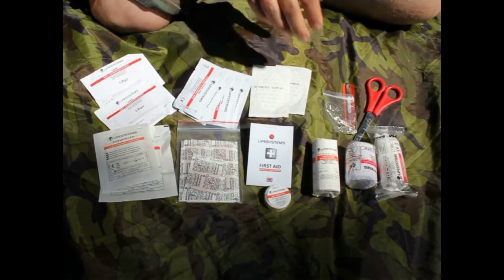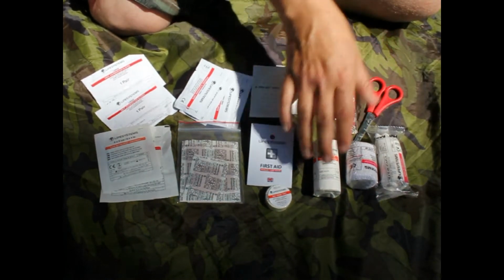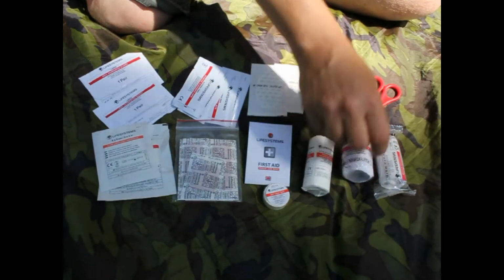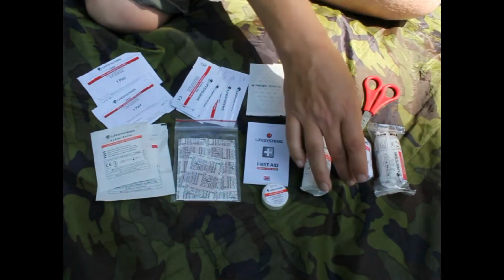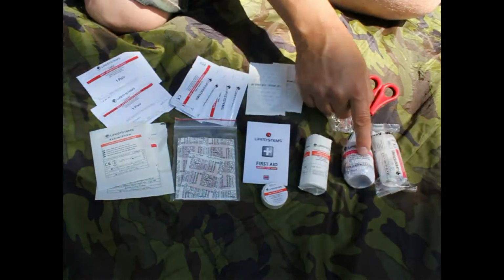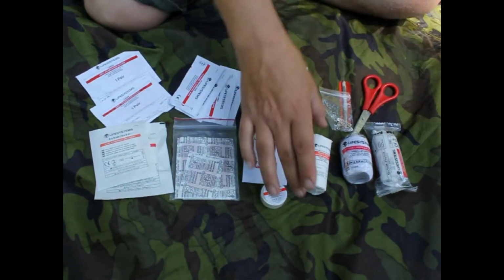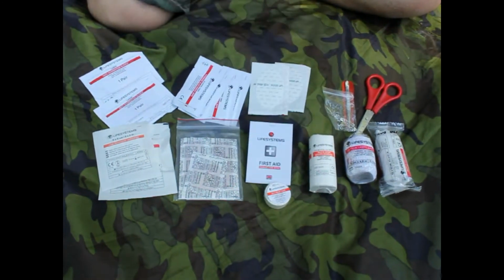And then you have 3 types of compressors or larger bandages. You have the elastic for sprains. You have this also for sprains or larger wounds, and you have this compress gauze here.